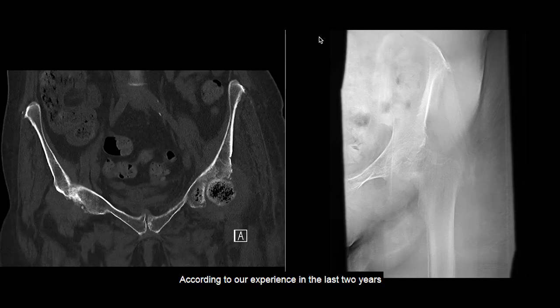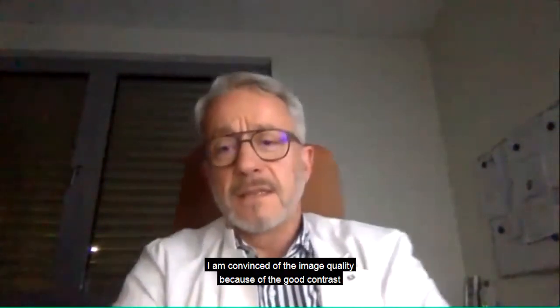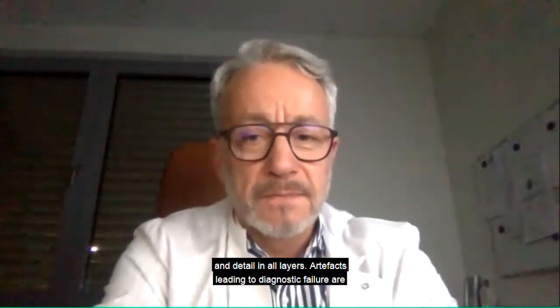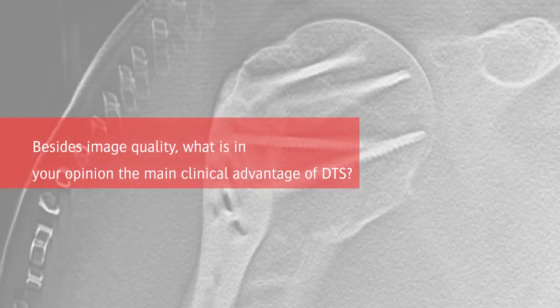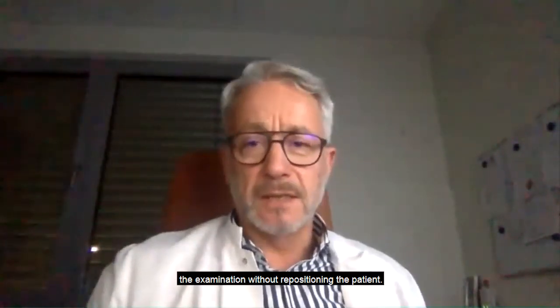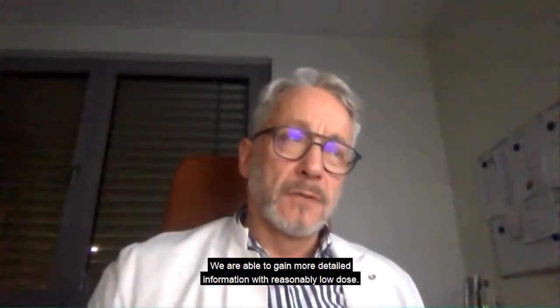Nicely seen here. According to our experience in the last 2 years, I am convinced of the image quality because of the good contrast and detail in all layers. Artifacts leading to diagnostic failure are really unusual. Consider performing an additional DTS. The main advantage is completing the examination without repositioning the patient. We are able to gain more detailed information with reasonably low dose.